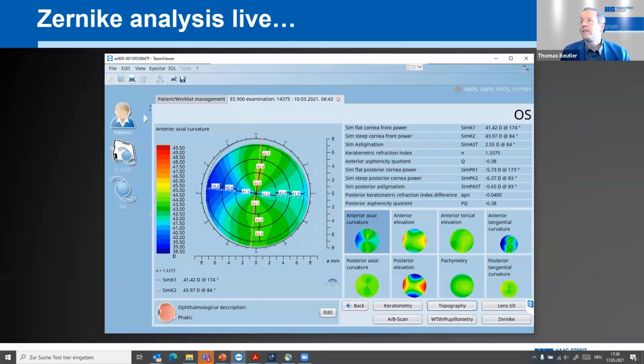Okay, then there are more questions. Yes, there's a one side mark. Dr. Hill said he would not use SimK for the IOL calculation. That's correct. And that's what basically I just said right now again. SimK are not of the same quality.